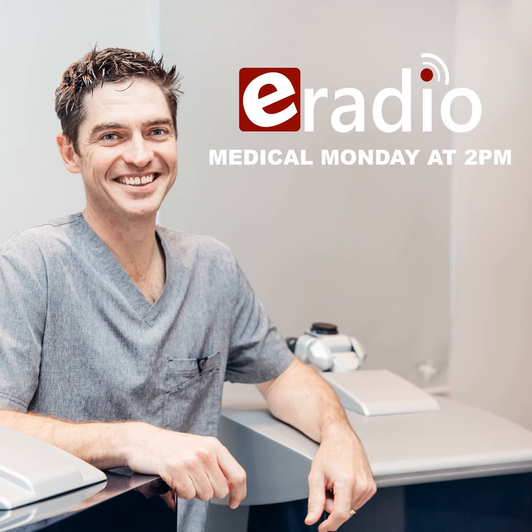And once that surface layer of cells has been removed, it then does your treatment. So although it is more elegant in the sense that we're not touching the eye, the recovery is pretty similar to the PRK. You still can have some discomfort for 2 or 3 days, although some of the studies show that the discomfort compared to PRK is slightly less, and in some studies that the visual recovery is slightly quicker. But on average, we warn these patients that 5 to 6 weeks is the visual recovery time.